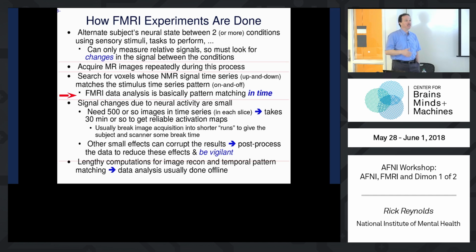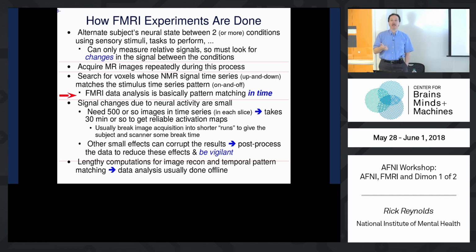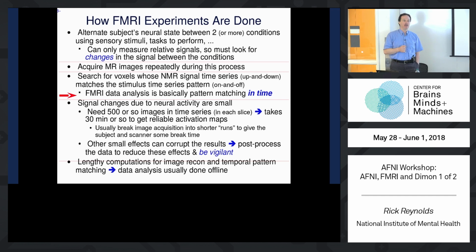But the main thing is when you're running an experiment, functional MRI analysis is based on contrast. So if you stick someone in the scanner for 30 minutes and give them visual stimulation the whole 30 minutes, and then analyze your data, you're going to see anything in the visual cortex? No, not a thing. It'll be just like they're dead or something. Well, I guess there's probably blood and breathing and stuff like that, so they're probably not dead, but maybe sleeping. But you won't see that the visual cortex is active, even though it is the whole time. It's because it never goes down.